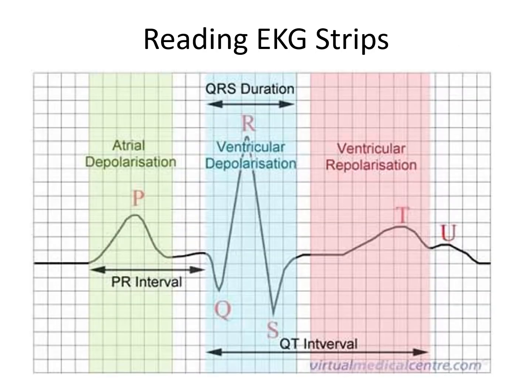This is a very nice picture of a single heartbeat, and we can refer back to it as we begin measuring these waveforms and time intervals, such as the PR interval and the QT interval.